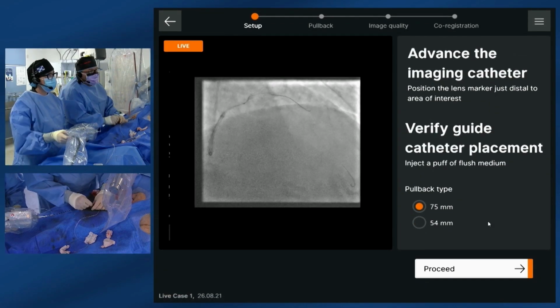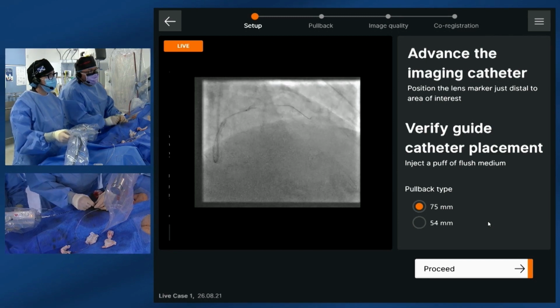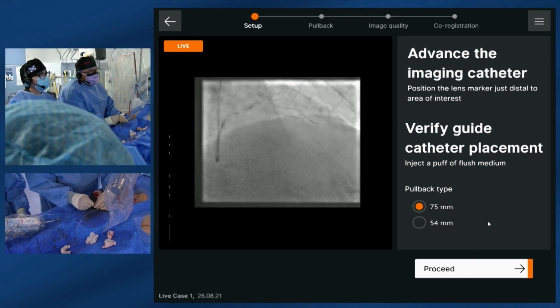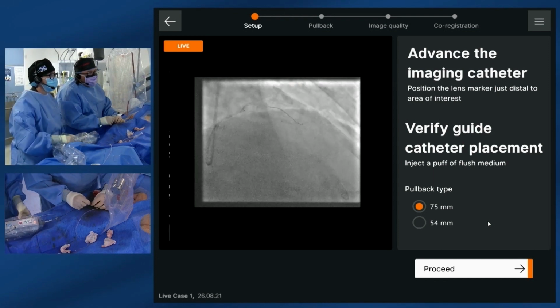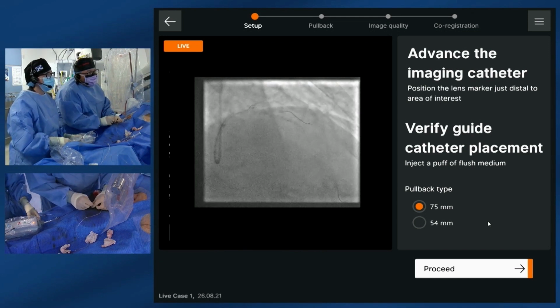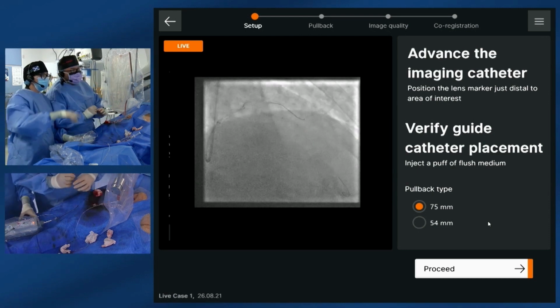So you can see the front part of the catheter is entering that severe area of disease. Yeah, I have to say it's very, very difficult. So we can even go from there because we'll see the left main bifurcation, I think. If we go down to the caudal view, we're probably further than we think we are. Just got a little bit of sustained pressure on there, but... Yeah. I mean, the OCT is quite trackable, but it just won't go any further. I think we'll struggle to get balloons across that, never mind the OCT.